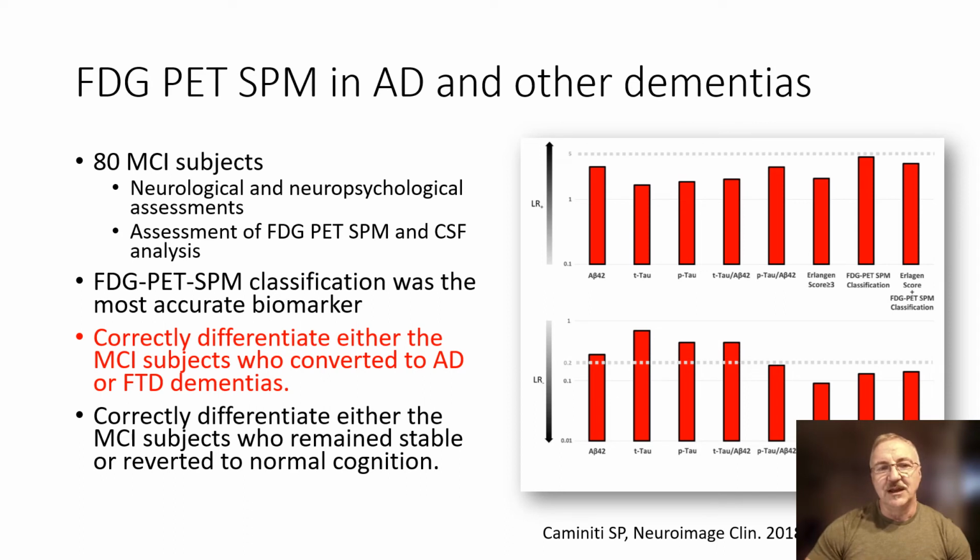And I want to mention SPM analysis. SPM analysis is something that I'm not going to show you today, because we want you to clinically provide a good quality service and in a detailed way, and we'll show you how to do that. But there is evidence that SPM can help.